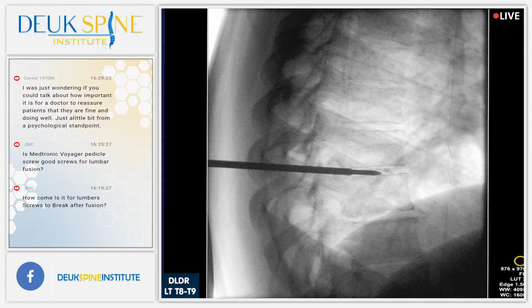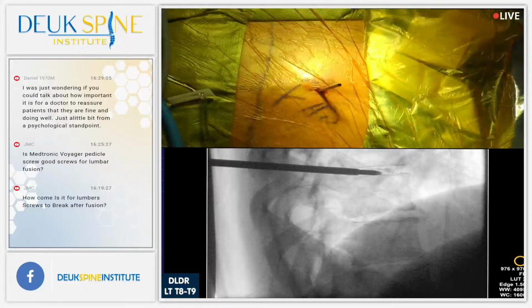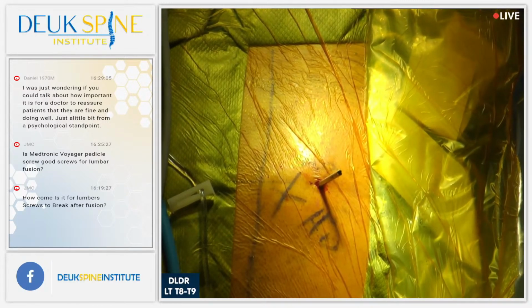All right, we are now into the annular tear, right where the herniation is starting. We're done with placement. So we're good. Take one more picture. There it is. So you can see the tube. We're going to do the whole surgery through that little tube.